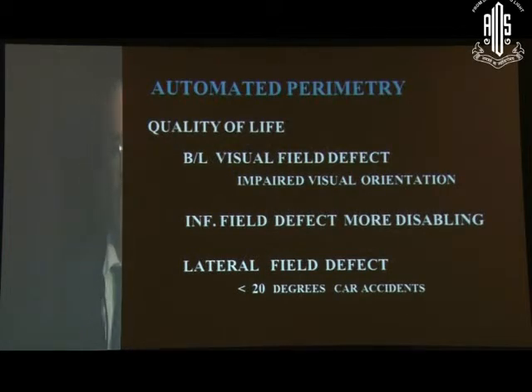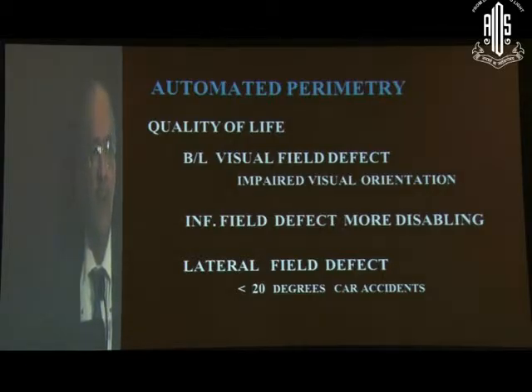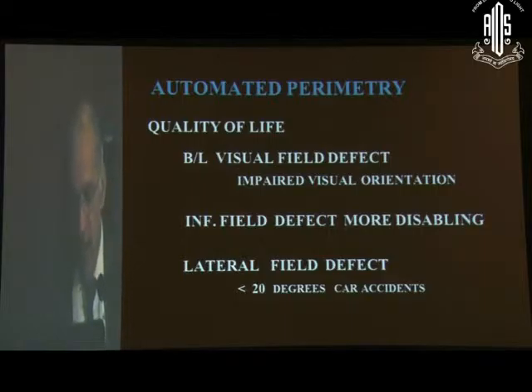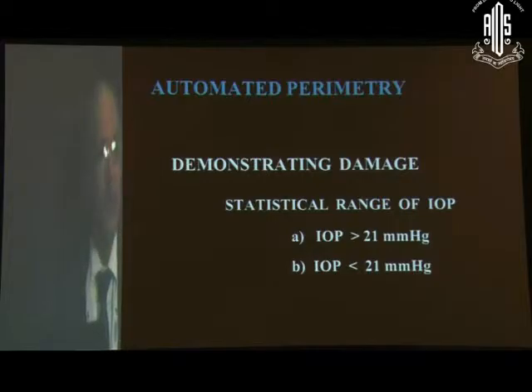Patient's quality of life is affected more if it's a bilateral visual field defect. It's affected more if it's an inferior visual field defect, or when there's a lateral field defect, because it interferes with the driving process. So is perimetry important in the management of glaucoma?